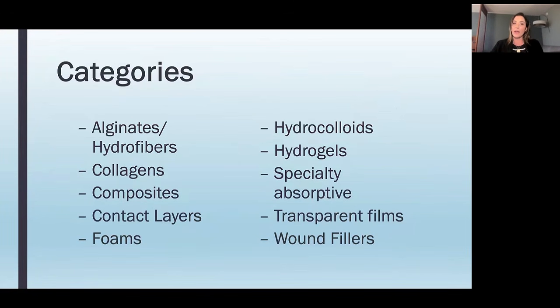So when we talk about the categories, I know we briefly went through them before, but we can talk about alginates and hydrofibers. I put them together because they're very similar. Collagens, composites, contact layers, foams, hydrocolloids, hydrogels, special absorptive dressings, transparent films, and wound fillers.